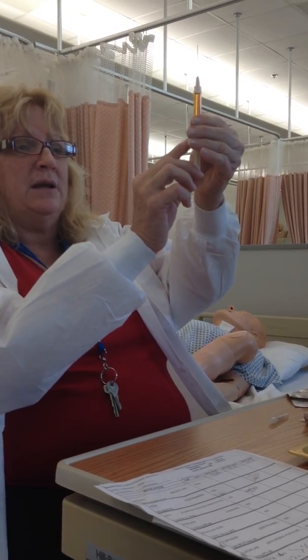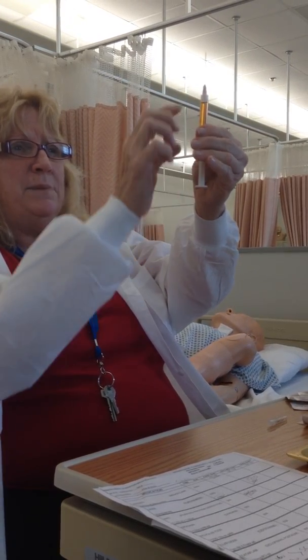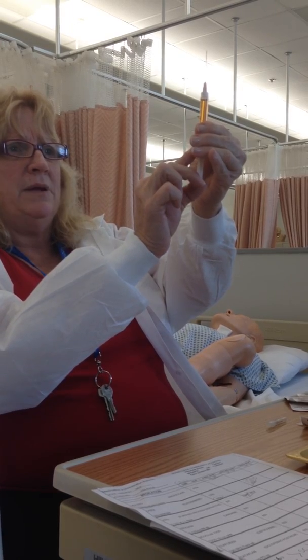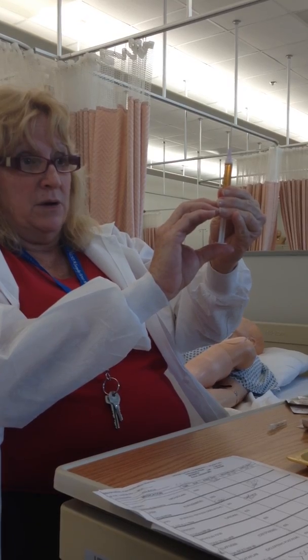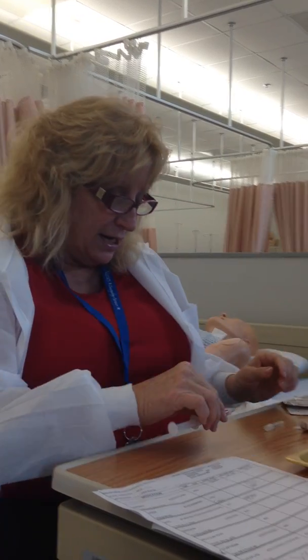Now if I draw down a little bit, I'm hoping you'll see it. There might be some fluid in here. There's a little tiny drop. Did you see it come out? Yeah. Okay, so now I'm going to go up with it, and I'm going to change it out.